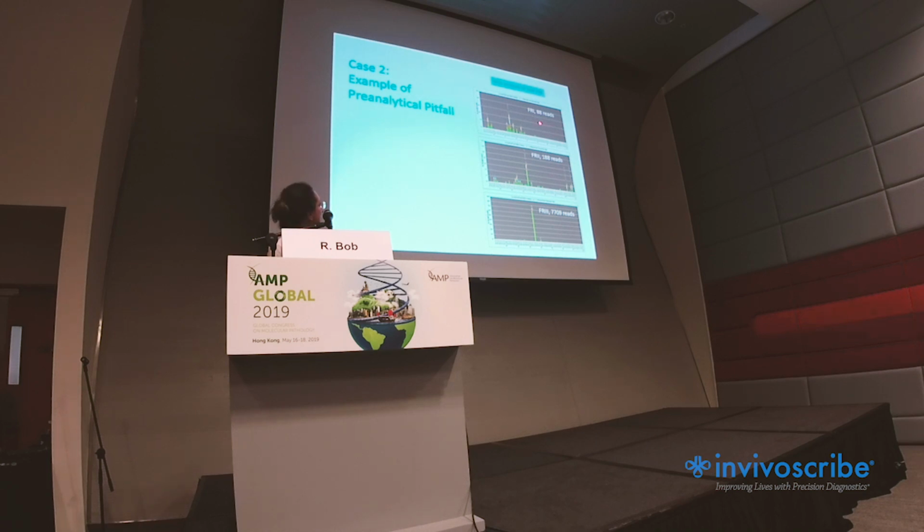Again, you see in framework 1 an oligoclonal pattern, or you may also say it could be a polyclonal pattern, but the number of reads is quite low. For framework 2, again, you have a dominant peak, but the number of reads is quite low. For framework 3, the same. It's okay, the number is 7,000, but it's still less than our cutoff. So to make the diagnosis, we now try fragment analysis.